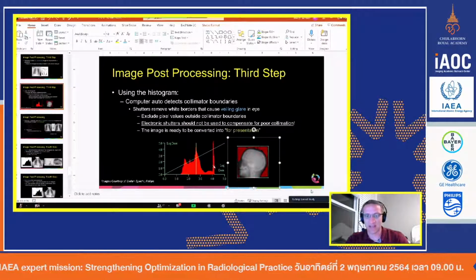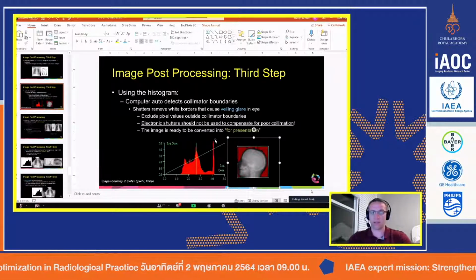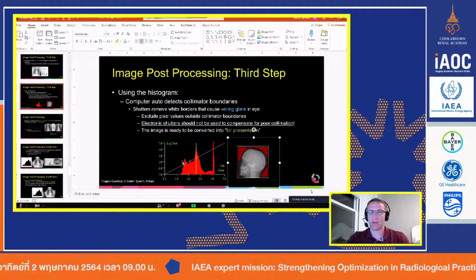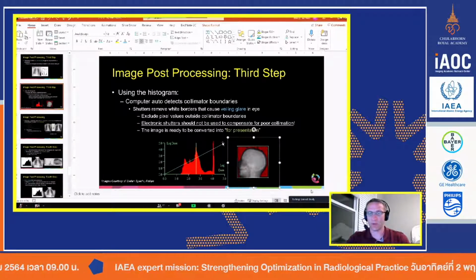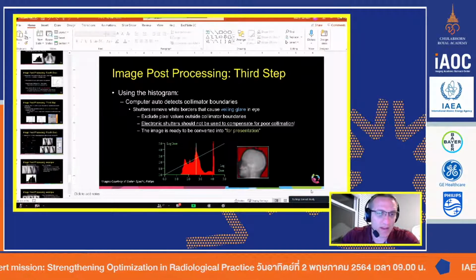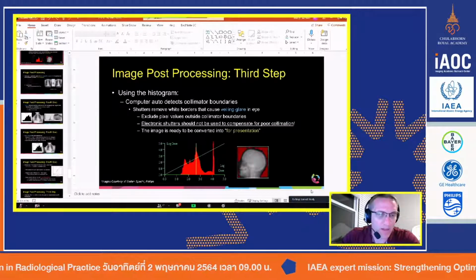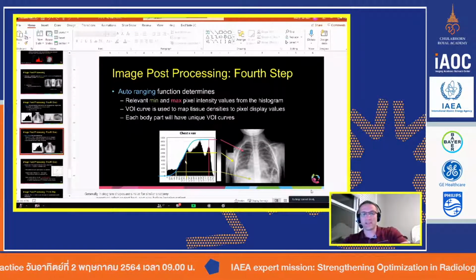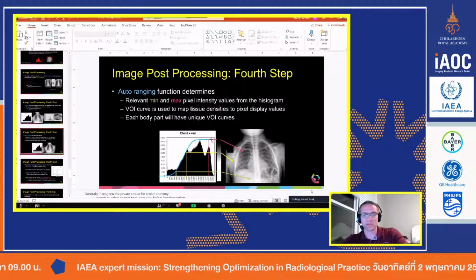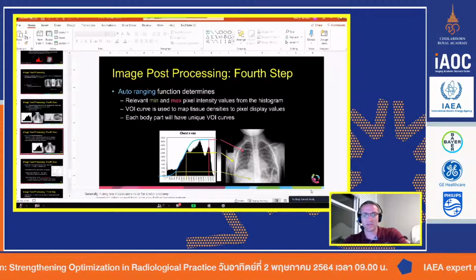That means this side of the histogram would be big. You would have a lot of pixels there. It might be taller or a little bit wider, but there would be a lot of pixels right here. Additionally, this part of your histogram would not go away because we wouldn't be able to cut out any of the excess. So how does that affect things? It affects it when you're setting the minimum and the maximum. Based on the shape of this histogram, we know where the minimum is and where the maximum is, and we set this blue line, this value of interest, based on the minimum and the maximum.